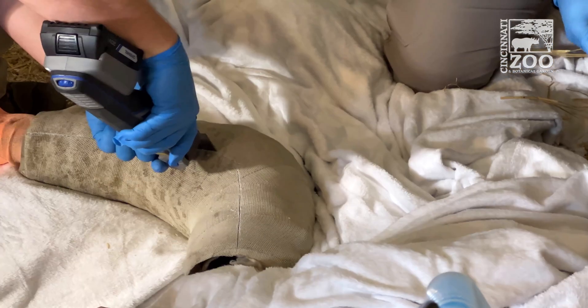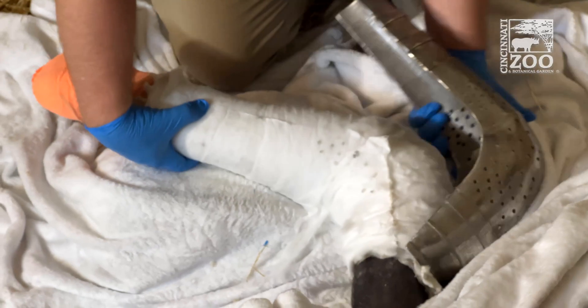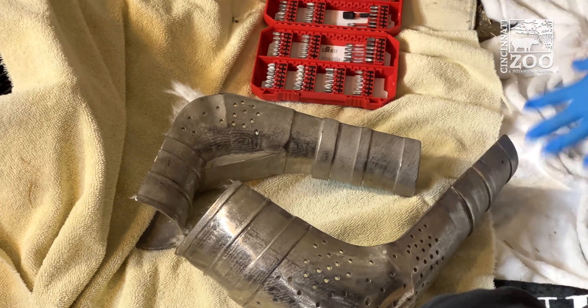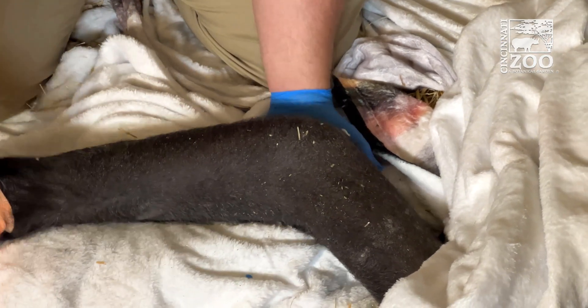We anesthetized Gladys for her recheck after her fracture repair, and to do so we had to remove the titanium casts. We did some passive range of motion just to try to loosen up her elbow a little bit and make sure that she doesn't get too stiff, which is to be expected after being in a cast for almost a month now.